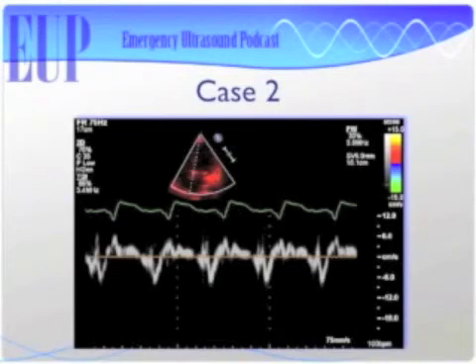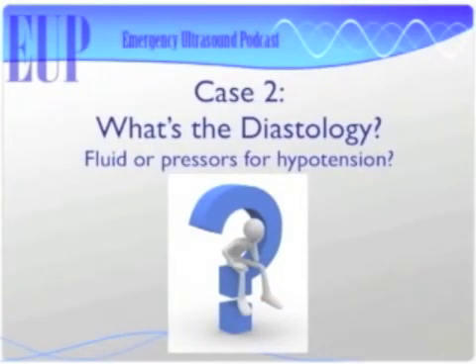So this person's pulmonary wedge pressure is what? What was the first number you said? 160. A lot. Yeah, 160 divided by 4. So does this patient need fluid or pressors? So this is a restrictive pattern. Pressors. Correct. Good guess. 50-50. So this patient has a really high preload and a really high pulmonary wedge pressure, right? They have plenty of volume going to their left ventricle to get the job done. So their problem is not volume, right? Right. So with this patient, okay, great.